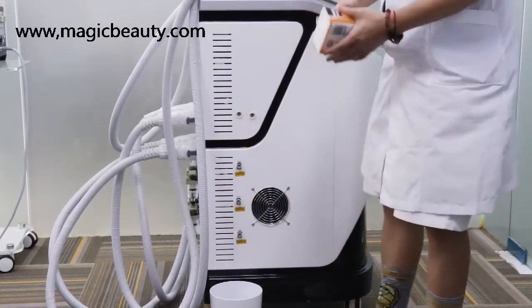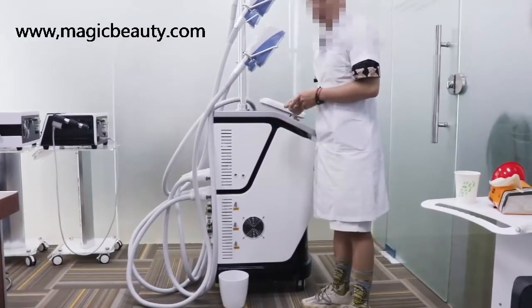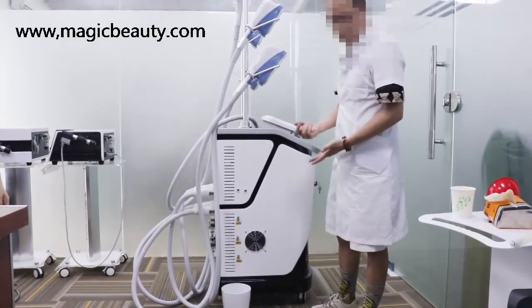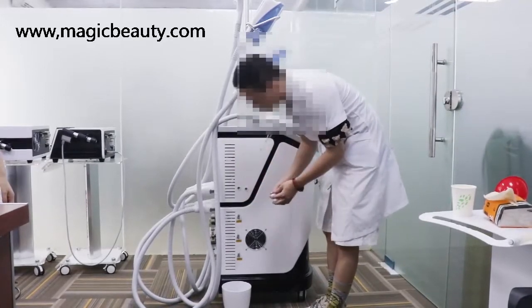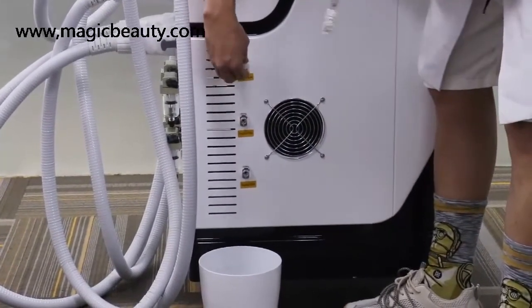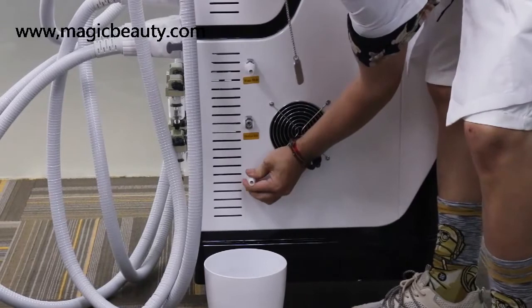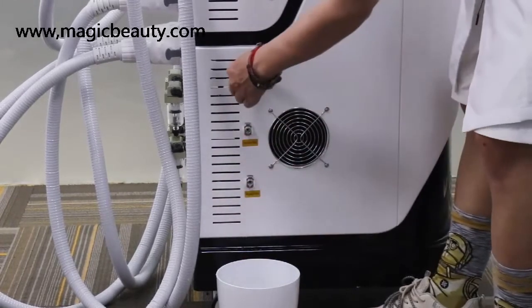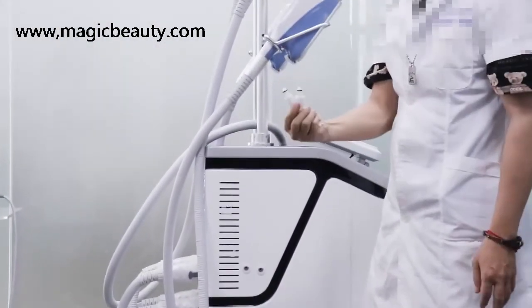The machine needs to have the water changed about every two to three weeks, or once a month. How to remove the water is very easy — you just connect all the connectors here to remove the water. Connect all here, put one connector here and one connector over here, and the water will come out. You can remove the water once a month this way. Remember these two important connectors for adding water or removing water.